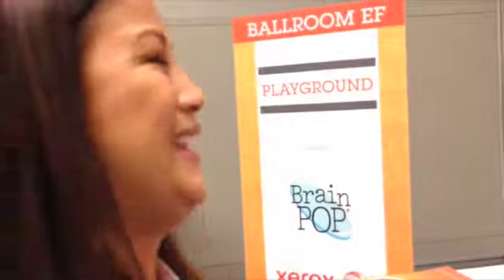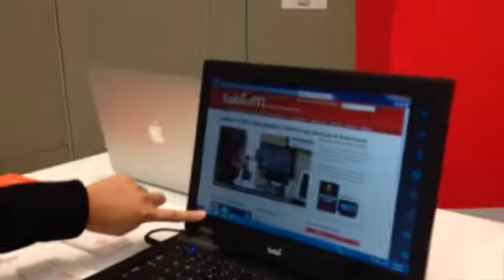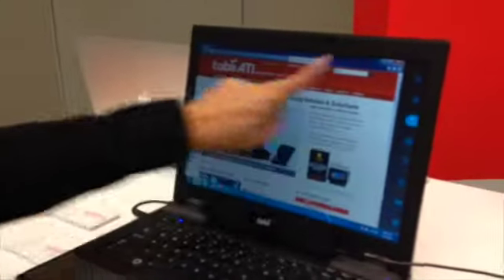And you turned it on, and that wasn't magic. That wasn't magic. That was science. That was technology. So what I did was basically tell the computer I want a single click on top of Internet Explorer. So I chose my function and looked right at the icon.